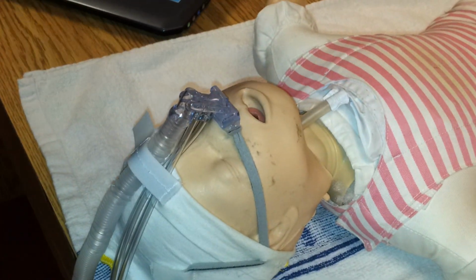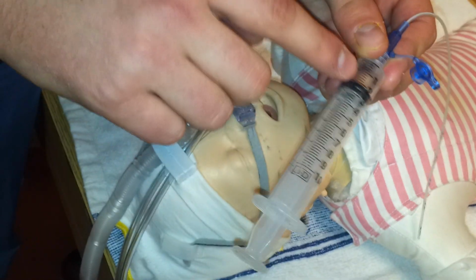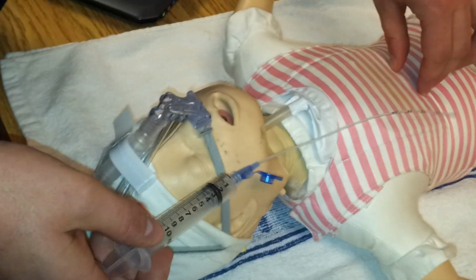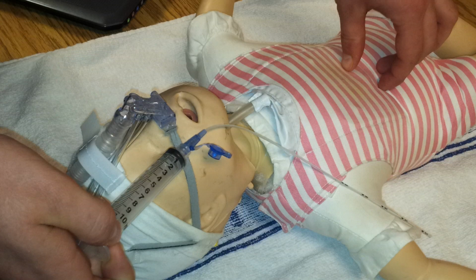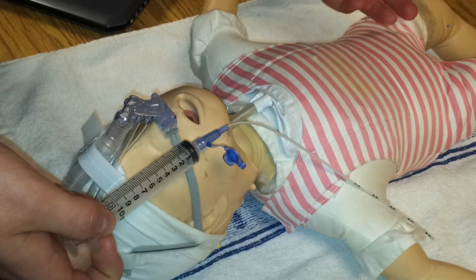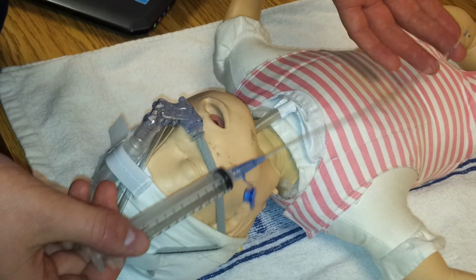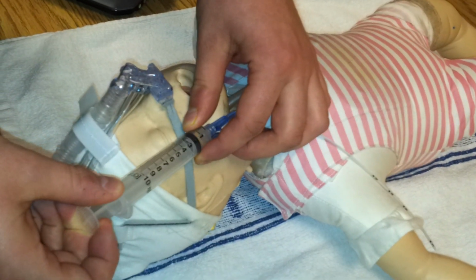Once you do insert it, you're going to put a little syringe on it with 2 cc's of air already hooked up. You're going to have your stethoscope listening over the belly, and you're going to push the 2 cc's in, and hopefully you'll hear that little push of air. If you don't, the orogastric tube is most likely in the lungs. So if you do hear it, you're going to withdraw the 2 cc's that you put in.